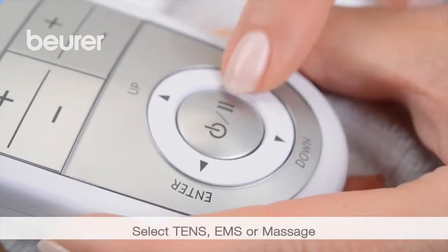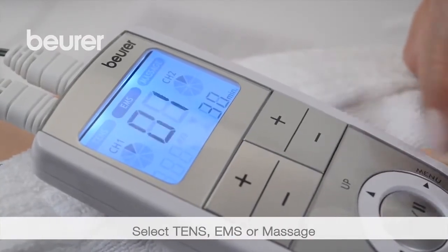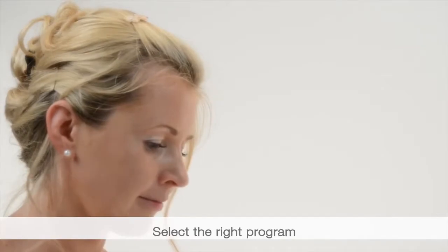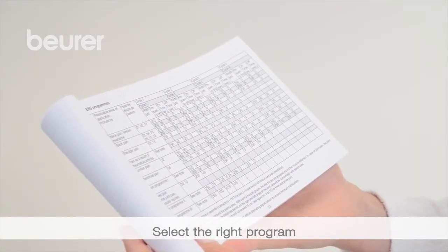Pressing the menu button allows you to navigate through the submenu. Select TENS, EMS, or Massage mode using Enter. Select the desired program using the Up-Down buttons and confirm with Enter. Find the right setting from the program table.